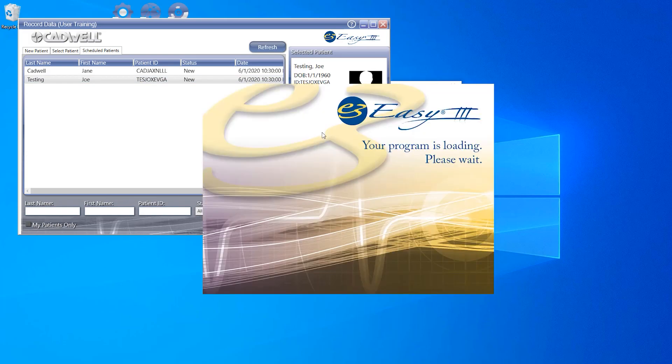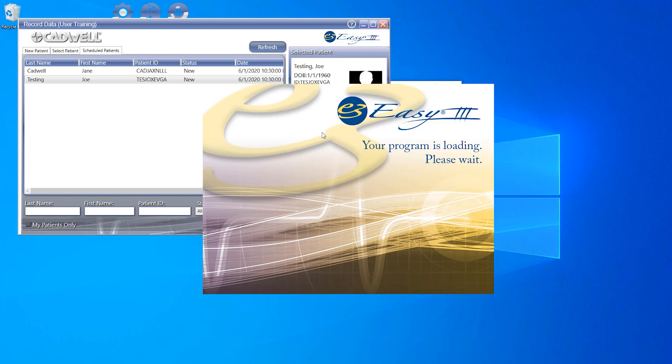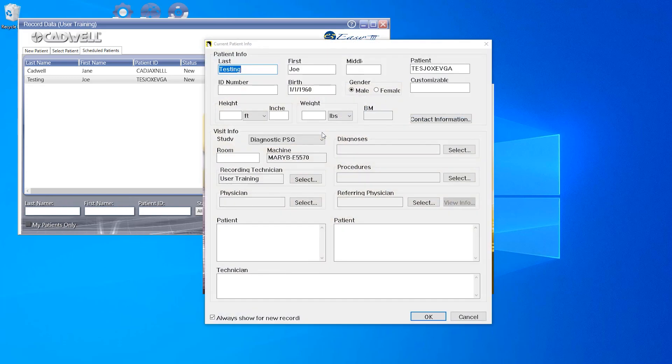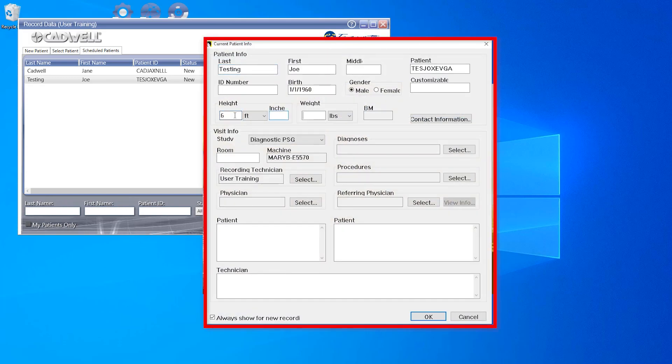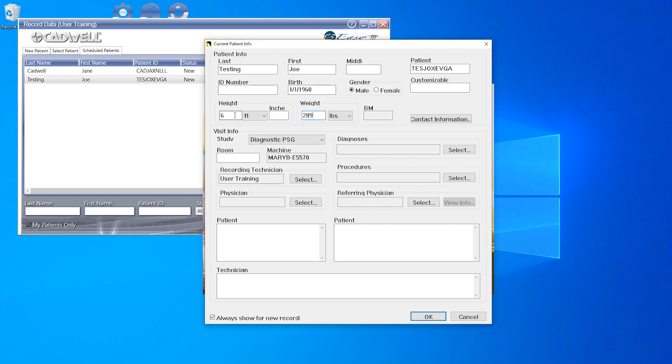After you have clicked the PSG button, the system will start to launch the EZ3 Collection workspace. You will stop at the current patient information window before your workspace is loaded. You may choose to input patient information at this time, or you can input the information later once your study is up and running. If you choose to put the information in at this time, do so into the appropriate fields and click OK when done.